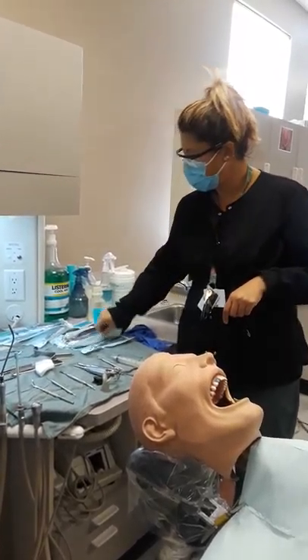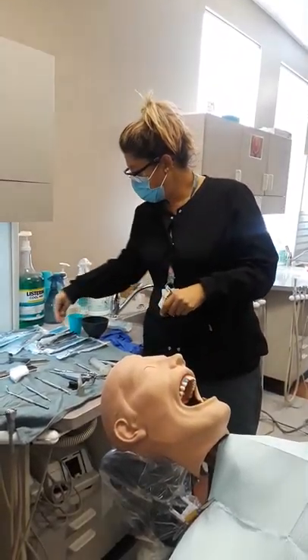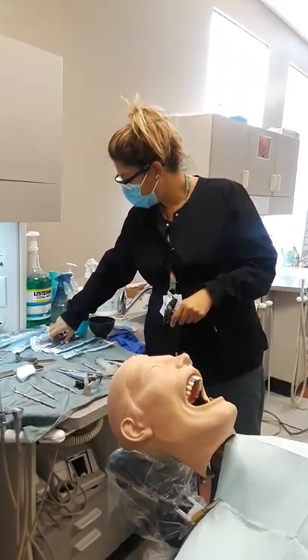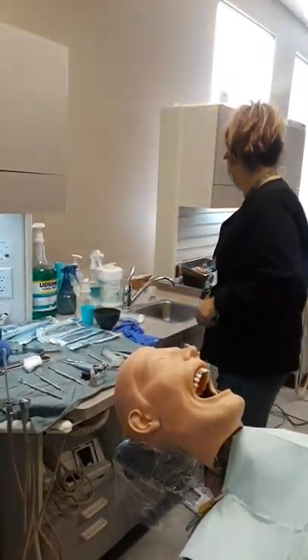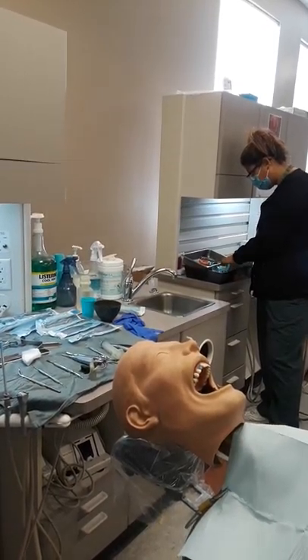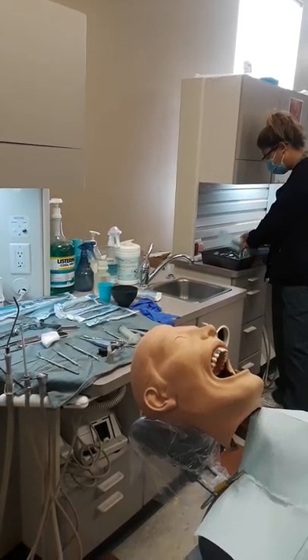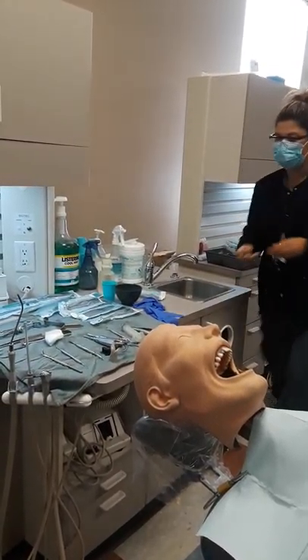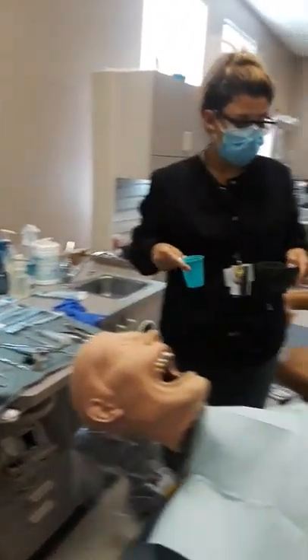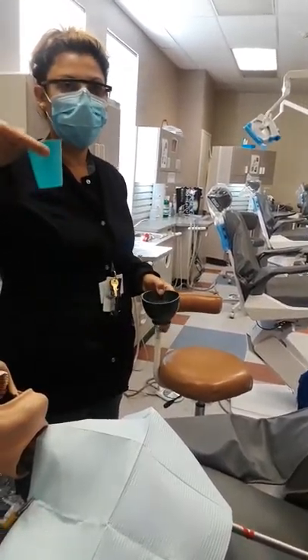It's a maxillary tooth, so we're going to need a 150, and maybe an 88. I have an 88L. I have two different samples — depending on your office, you can put water in the bowl like this, or water in a cup.